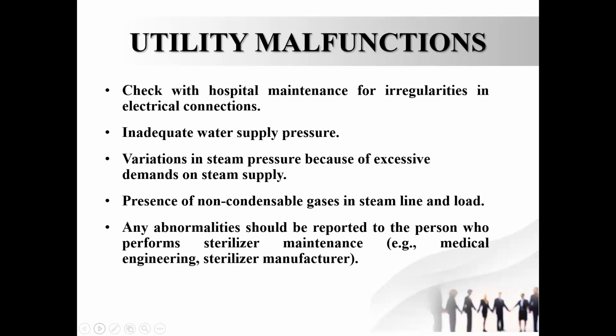If it is central steam, because many departments are making demands on that particular boiler, you may have non-condensable gases in the steam line and load. You have to get rid of these. Or there may be other abnormalities, and all these should be reported to the person who performs the sterilizer maintenance.